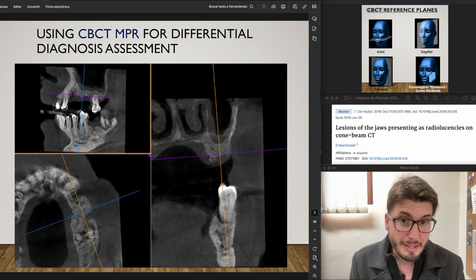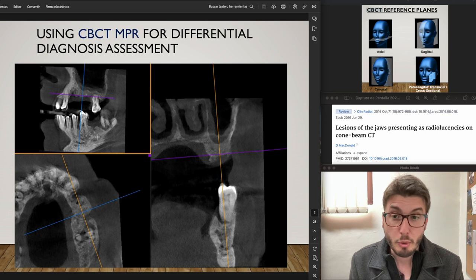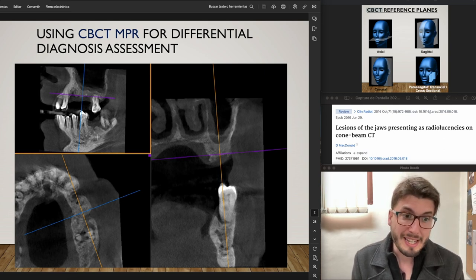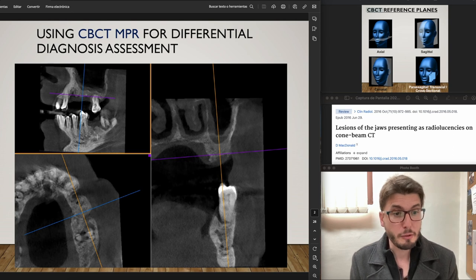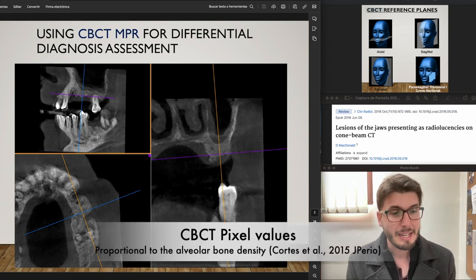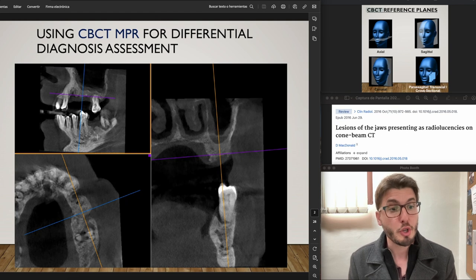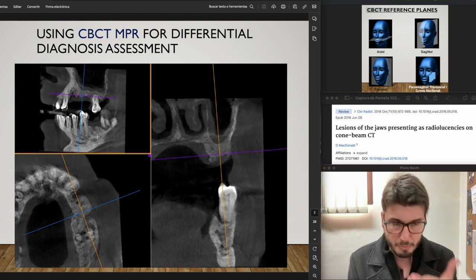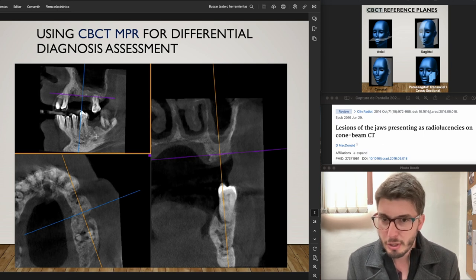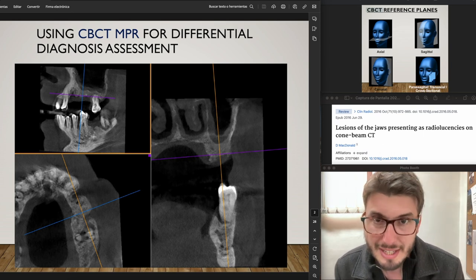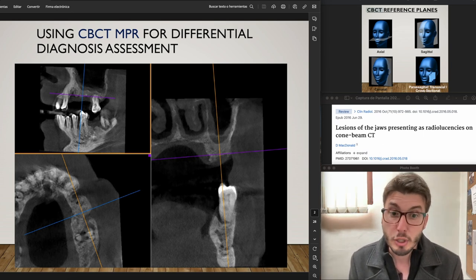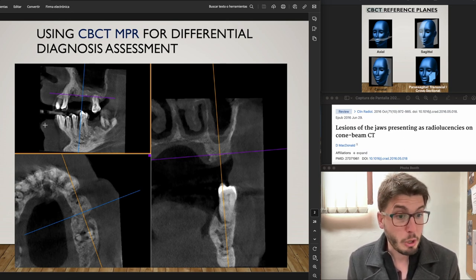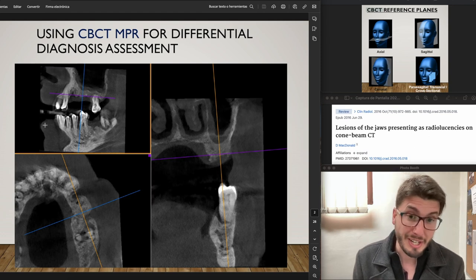We can assess not only the level but also the density of the bone. You cannot assess the density of the bone itself, but you can assess the pixel values, which are proportional to the density of the alveolar bone. There are several papers describing this methodology. And don't forget that CBCT is used for surgical planning as well, not only for diagnosis.